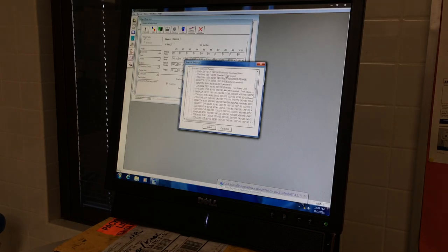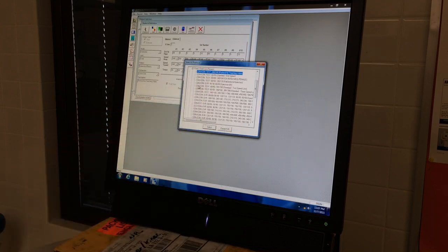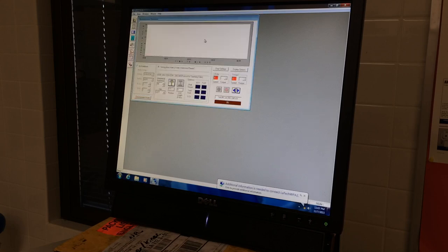We click on that. And then you'll see here, we have it named protocol test for teaching video. We select that, and then we hit close after we've selected our protocol. Again, you can change and set up protocol specific to your needs. Again, this will come down to individual studies and what your advisor and or professor is looking for.